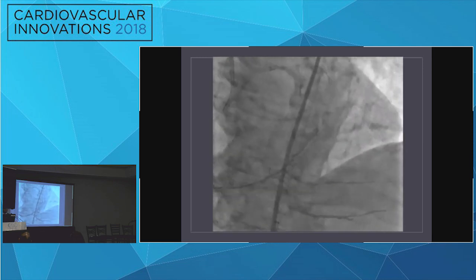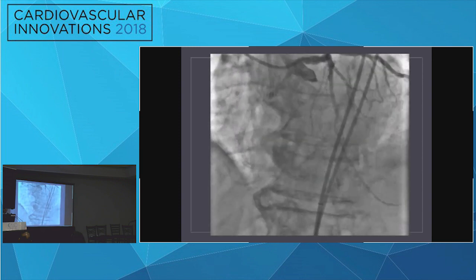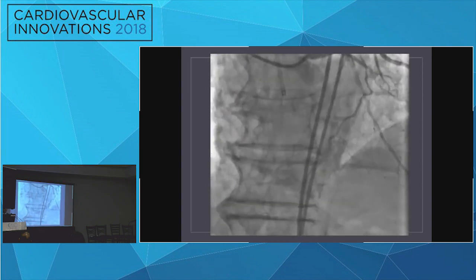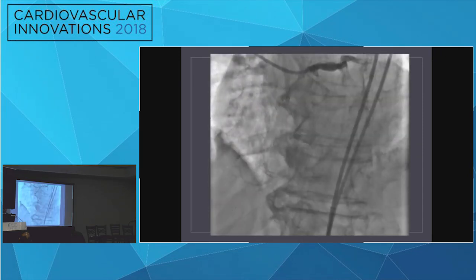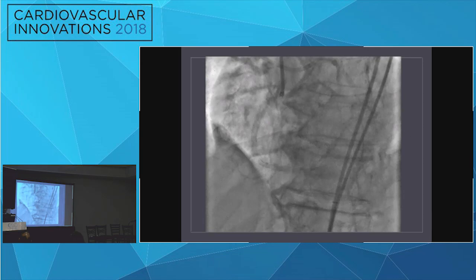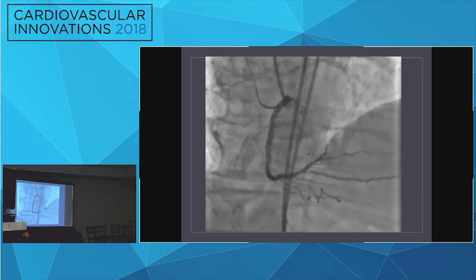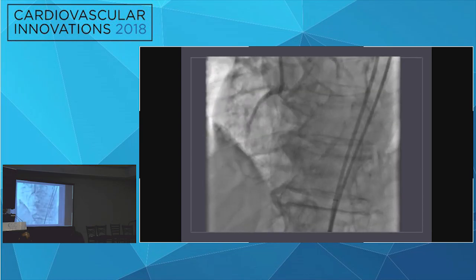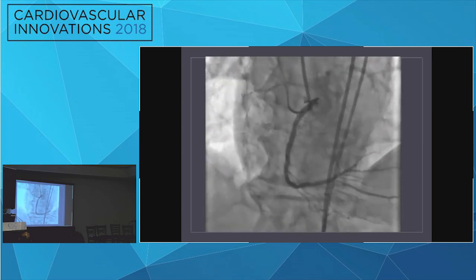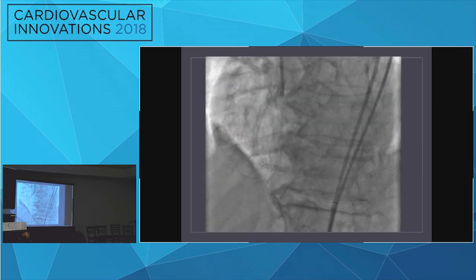There is still an 85% ostial right PDA, but I elected to stop there. This is a left angiogram that shows no complication in that circ system, and a right angiogram showing 0% residual and TIMI-3 flow in all the branches. This was my first, actually, retrograde intervention a few years ago.